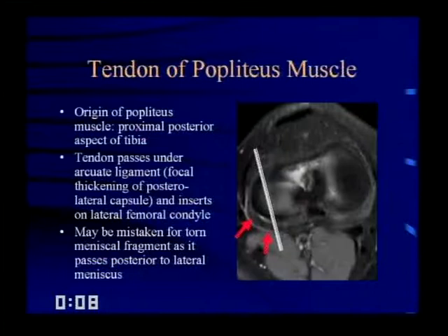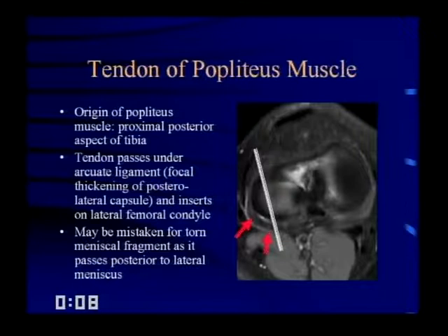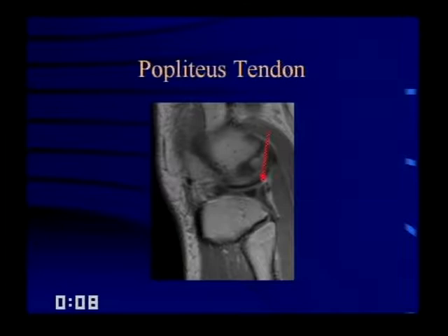The popliteus tendon can mimic a tear on occasion. The muscle originates along the posterior aspect of the proximal tibia, sends its tendon around the posterolateral corner of the lateral meniscus, and inserts on the femoral condyle. On a sagittal slice through the meniscus that also catches the popliteus tendon, it may look like a tear. The key is to follow it down and recognize it as part of the popliteus muscle.